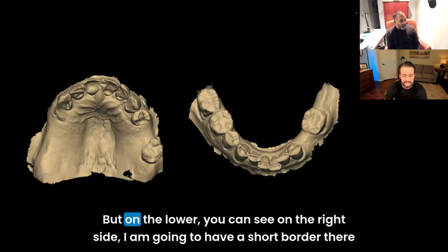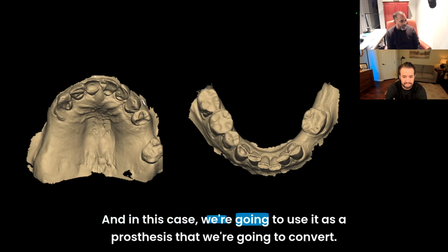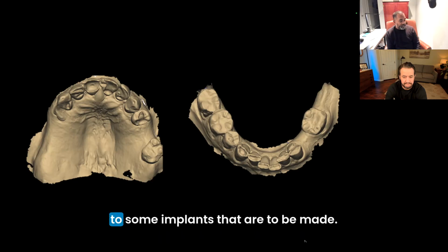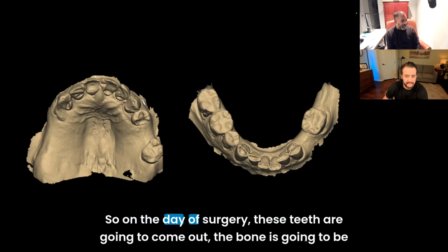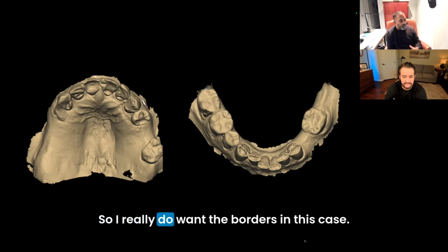But on the lower, you can see on the right side, I am going to have a short border there as well. And in this case, we're going to use it as a prosthesis that we're going to convert to some implants that are going to be made. So on the day of surgery, these teeth are going to come out. The bone is going to be reduced. And then I have very few landmarks to basically place this denture back in. So I really do want the borders in this case.